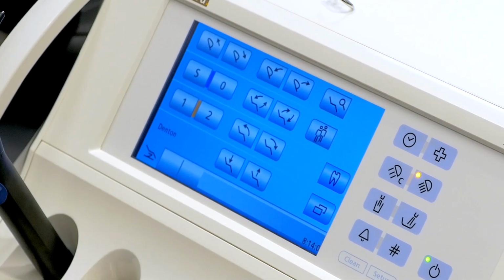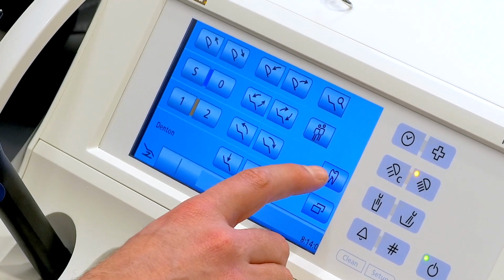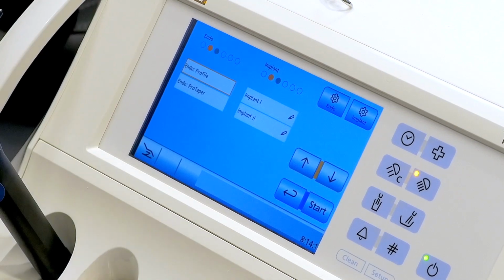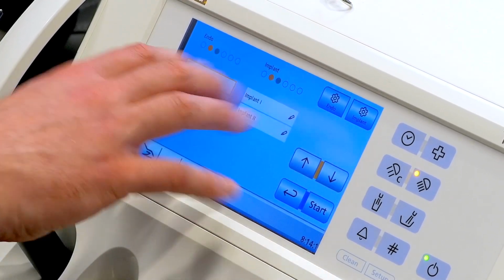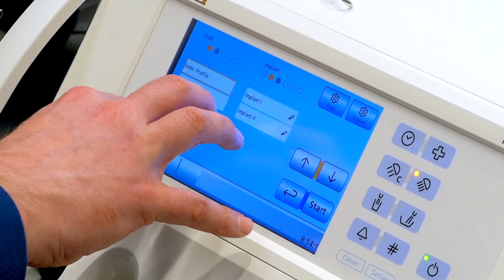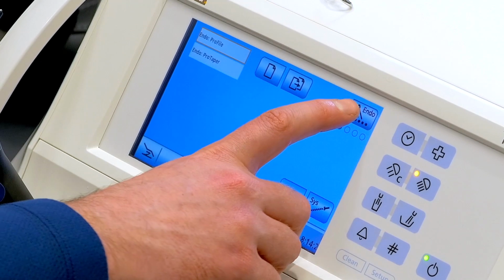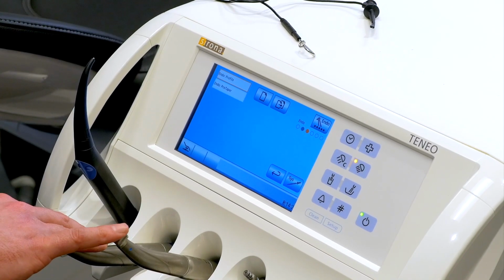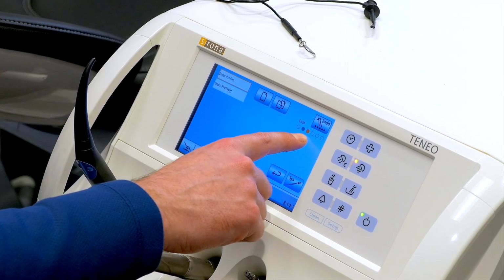After you proceed in getting a working length, you can activate the integrated endodontics by pushing the clinical procedures button with the picture of a tooth on it. Then you're going to go into the endo menu here. On this menu, you have several different options. When I tap the endo button, I can then select which position I want to do endodontics on. In this case, we have 2 electric motors, so I can pick which position I want it on.